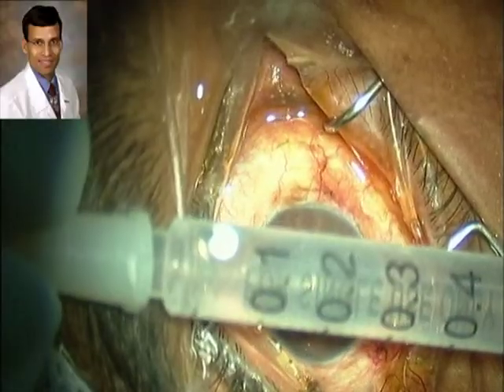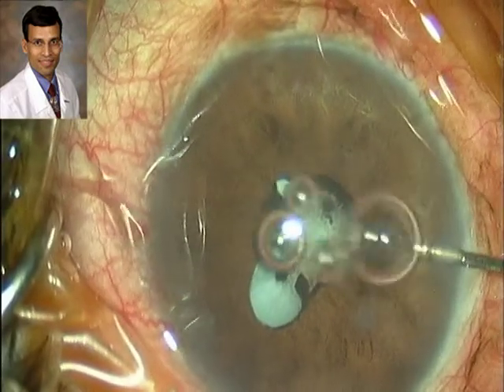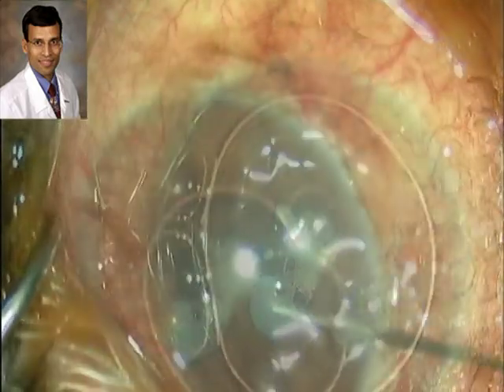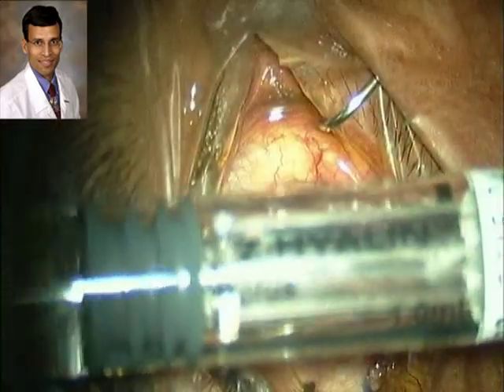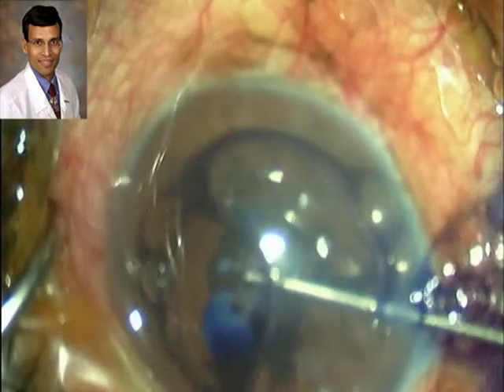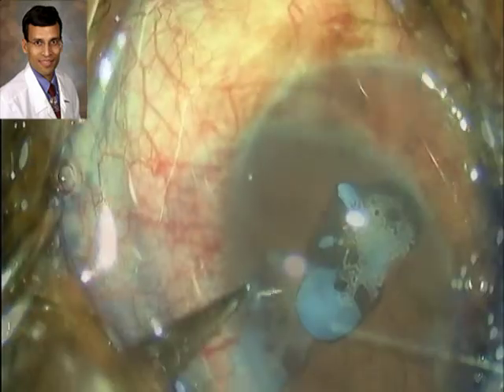This is an irregular pupil, and because it had not dilated, we first inject intracameral preservative-free lignocaine into the anterior chamber, and under an air bubble or with the soft shell technique, we stain the anterior capsule. It is also a good idea to use Viscoat or Z-hyaline, etc., which can protect the corneal endothelium well in the case of additional maneuvers needed in these surgeries.